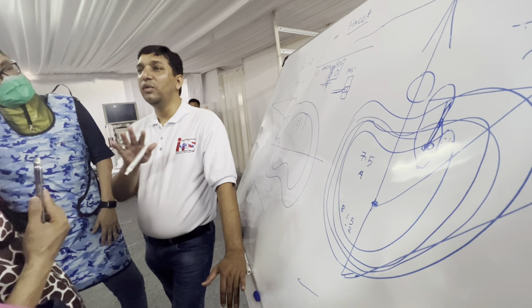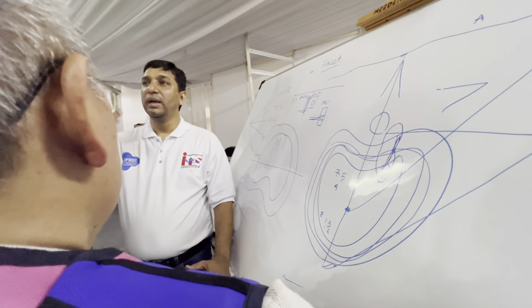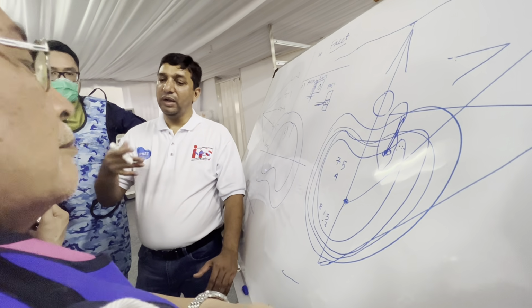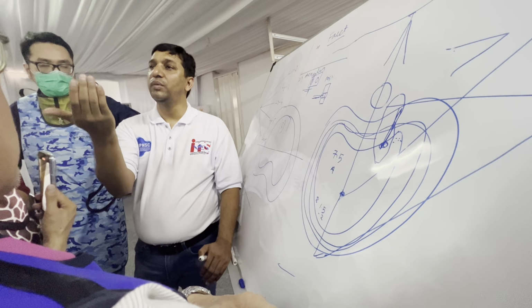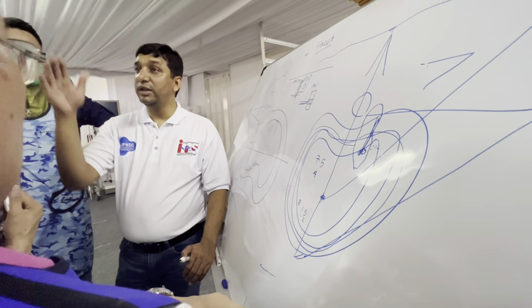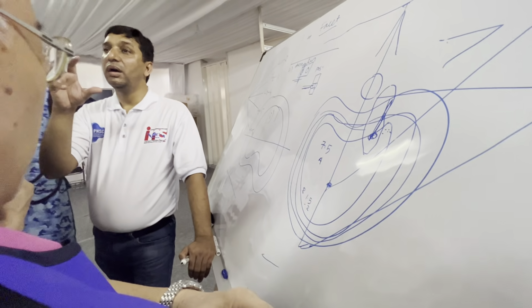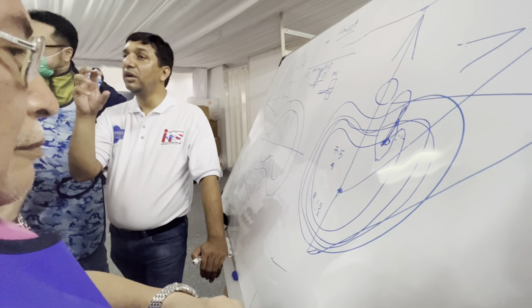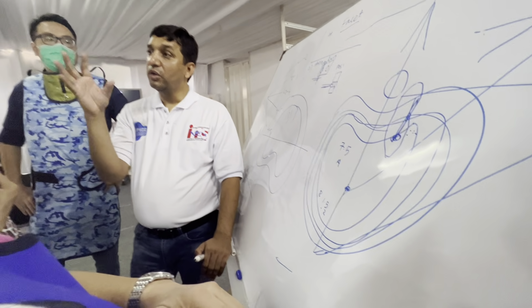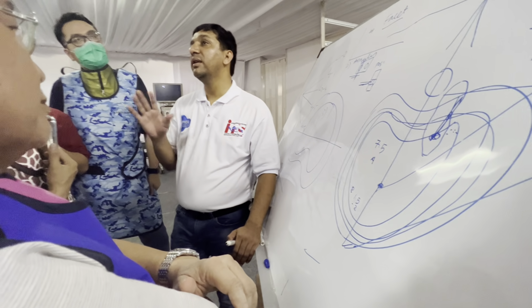Then you will not make any mistake, and once you remove the herniation, you will see the free movement of the epidural space. You can even put the hook through the annular tear, and you will be able to see the hook going up to the annular tear. So it means now the space is free. And if you come out more, you will be able to see the pulsating nerve root also, or you may see the pulsating nerve root along with the fat. This free pulsation is an indication that the compression on the nerve is finished.